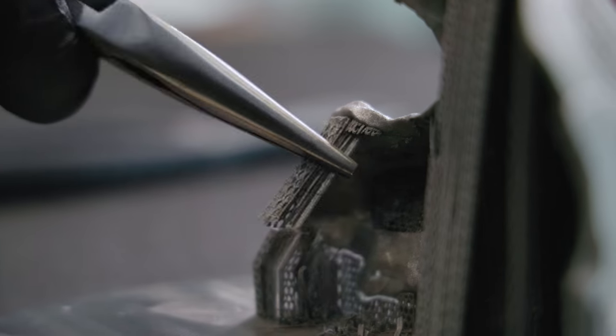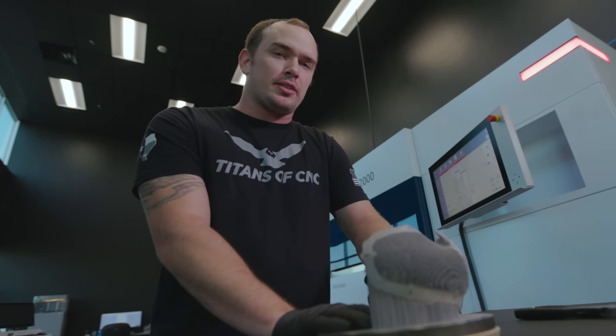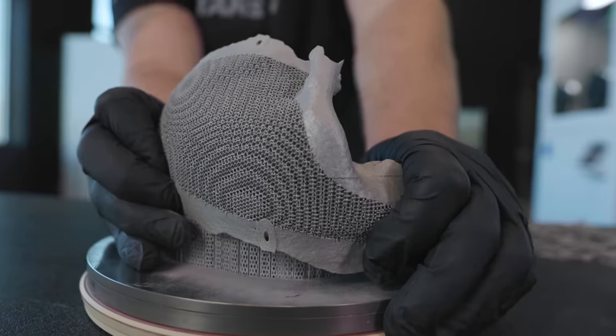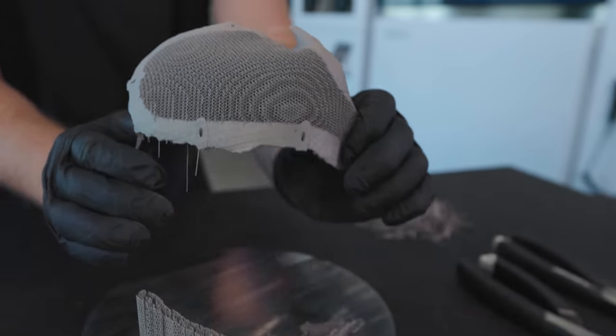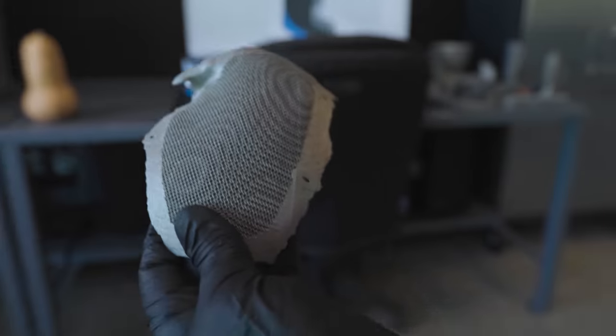And this part just goes to show — if you're in machining and manufacturing, the work that you're doing every single day is impacting someone's life, whether you see it or not. It's an absolute honor for me to be able to make a part like this that has so much meaning and history behind it.